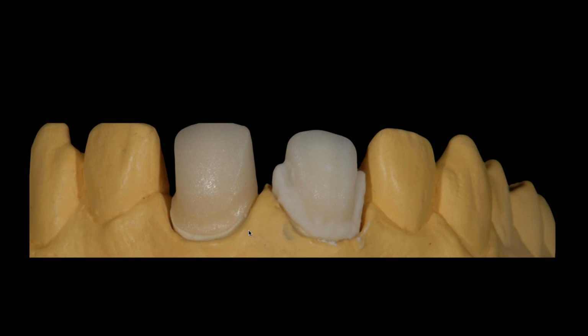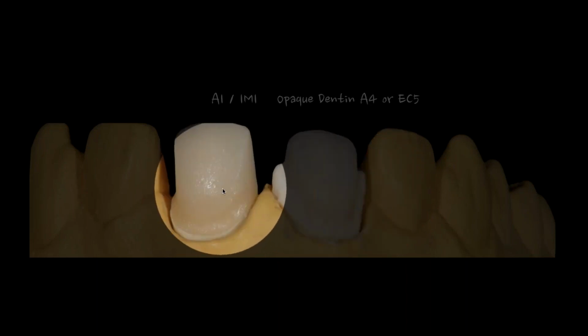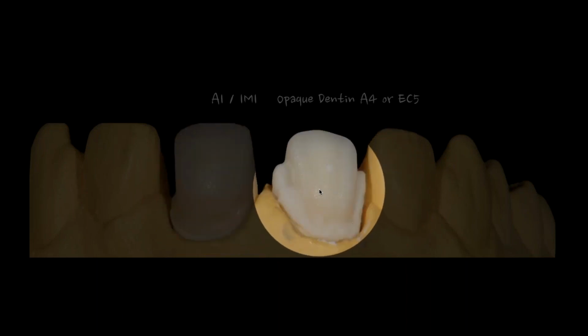So here's what I'm going to do. The goal on these two restorations is going to be to make them 1M1 A1-ish. So that's kind of the goal. So keep that in your brain. We're going to go for a 1M1 A1 kind of a look. And I'm going to start by taking my Opacious Dentin material, and I'm going to use it interproximal, cervically, and more up to the interproximal. I'm not going to put any on the tooth next to it. I'm only going to do it on the number 8 that's here, okay?